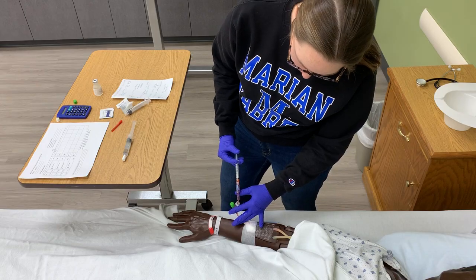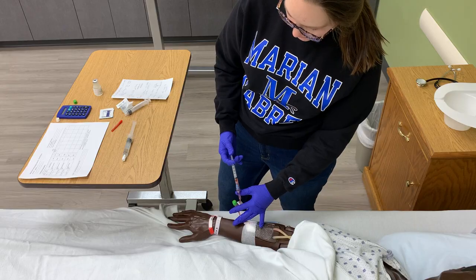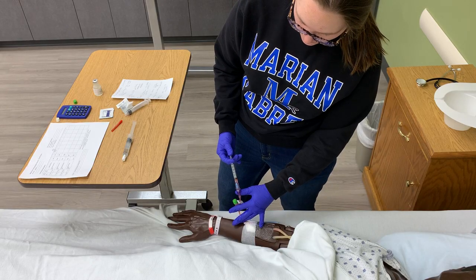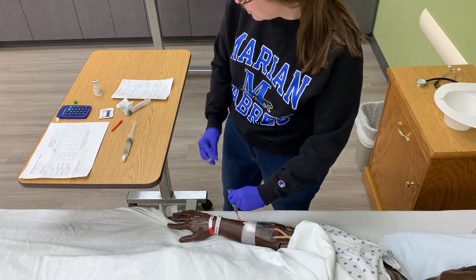And pushing another 0.3. All right, I'm pushing another 0.3. And now we're done. So now I'm going to remove the syringe and we're going to alcohol that off again.